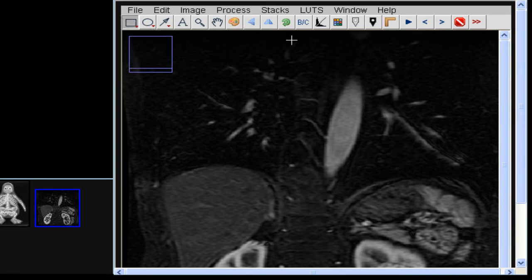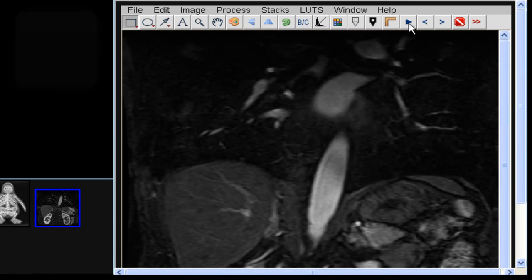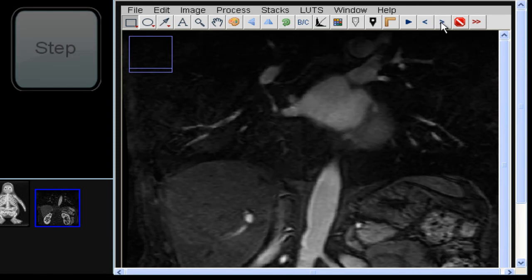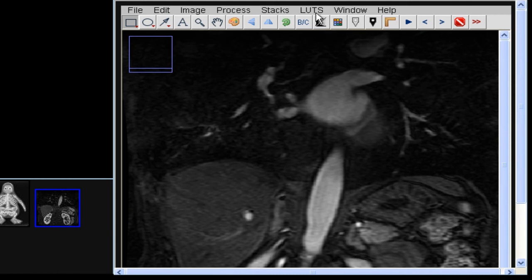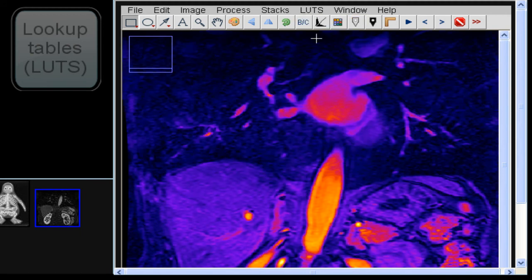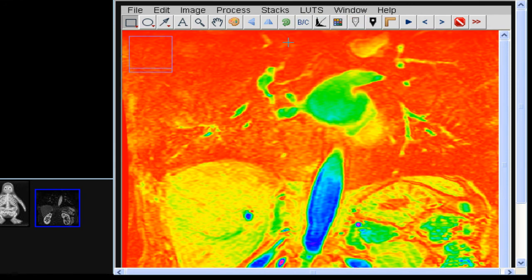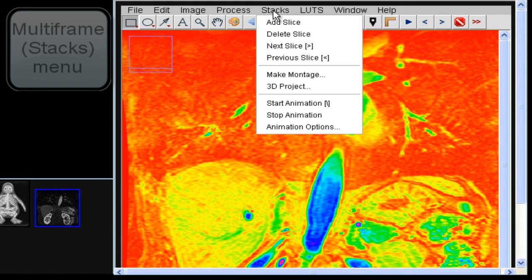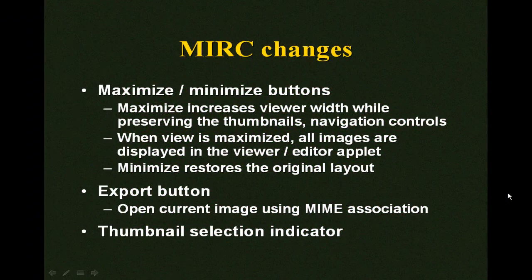The toolbar also contains three buttons for viewing multi-frame images. The image is animated and plays in a loop by default. Users can also step forward or backward a frame at a time. A lookup table menu was added so users can apply color filters to monochrome images. A stacks menu was also added, containing operations that can be applied to multi-frame images.